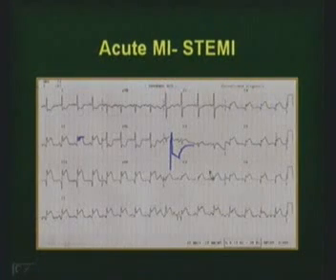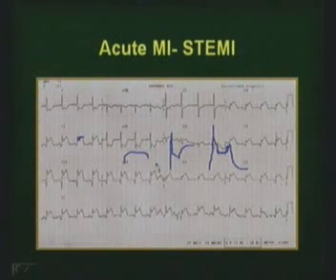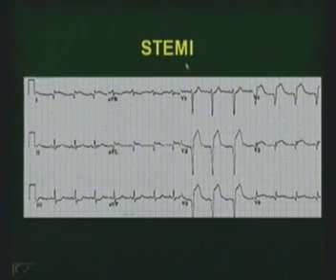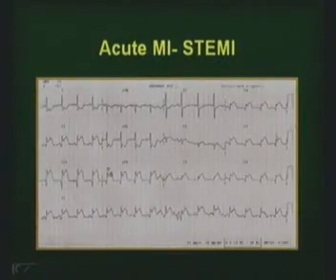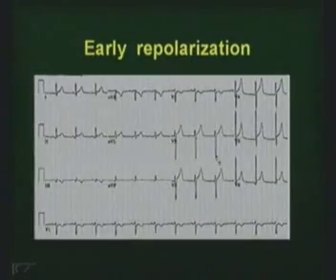Whereas for a pericarditis, it may not be convex like that, so it is like this. So that's the difference between convexity. Okay, so this is curving like this in MI, whereas that it is curving like this. So this is an inferior and lateral MI. This is an ST elevation MI, the terminology used now, STEMI, in the anterior leads, V1, V2, V3 and V4. Here the Q wave is already formed. That was an hyperacute stage. This is an acute or an anterior wall MI of some duration. We still have ST elevation, so it's an evolving anterior wall MI.